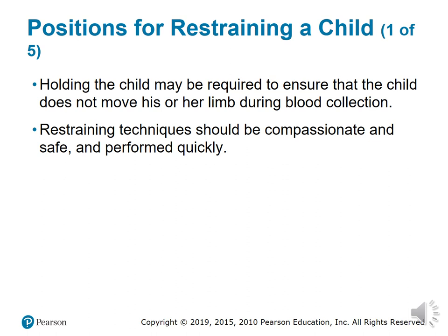We do instruct the patients on different types of holds that we do have. Like if they're sitting in a phlebotomy chair and they're small enough, we have the parents sit down and place the child in the parent's lap, put the protective bar in front of them, and they'll do it as a hug. They will put the arm we're not using on the side of them, and the parents will crisscross their legs in front of the kid's legs so they don't kick out.